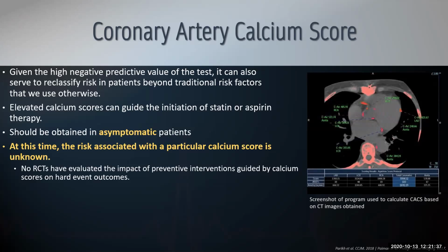How long does the study take? Both the coronary calcium scores and the CTAs are just like CT, so they're very quick. They're done in a few minutes. It's the interpretation of them that usually takes more time. From when I've talked to radiologists in the prior places I worked at, not the ones necessarily here, the nuclear takes a lot longer for them to read than it does for the coronary CTA, because the computer does all this work for them, as you can see in this printout, and then it prints out the number. So literally they're just dictating what the number is showing. So these are very fast to do, which is why we use the coronary CTA as a way to, I don't want to say get rid of, but discharge our OBS patients faster.